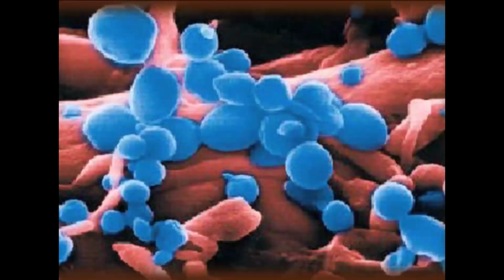Let us now move to the third parameter of the physical condition, that is the pH of the medium. The pH of the medium plays a very important role, as if the pH increases or decreases, then the growth of the microbe will become diminished or the microbe will die. pH is the hydrogen ion concentration. Now we add suitable buffers like sodium and potassium phosphates, or sometimes sodium carbonate is added to the medium to maintain the pH of the medium, because there are certain bacteria, like acidophilic bacteria, which prefer a low pH.